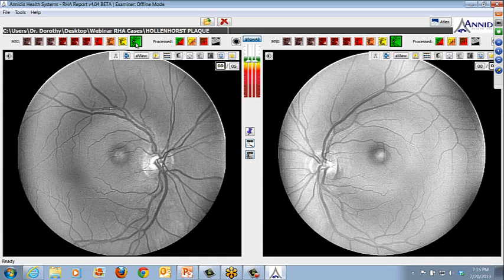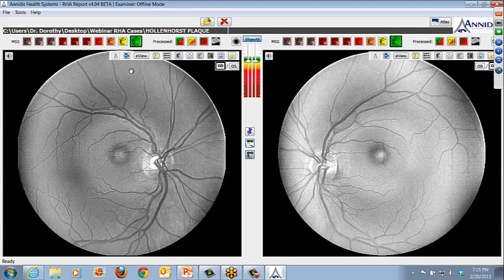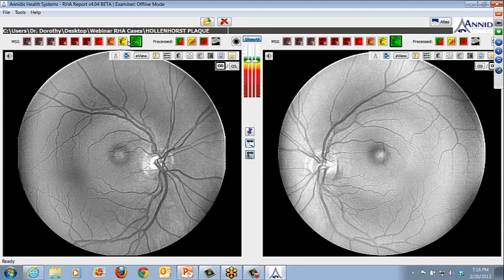And so we did a screening on her. I tend to do the full spectrum screening often. And what I saw in her here, and again, greens, yellows, you're going to highlight and have most defined the retinal vasculature. And you can see nicely highlighted here in the green. And remember, a Hollenhorst plaque. I think most of you would be able to identify that.